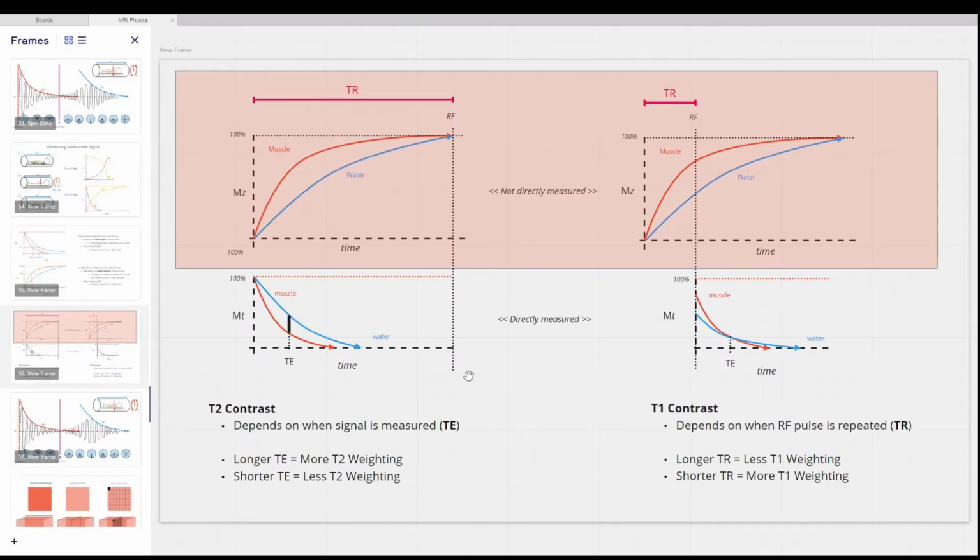We talked about how this is our idealized T2 contrast, right? But in actuality, what we're getting is something like this, where there's some degree of T1 contrast also encoded in our signal. This should look familiar. I'm not going to go through it all again, but what we actually see a lot of the time is something that looks like this right here on the bottom right, where there's some degree of both the T2 information as well as the T1 information in the signal.